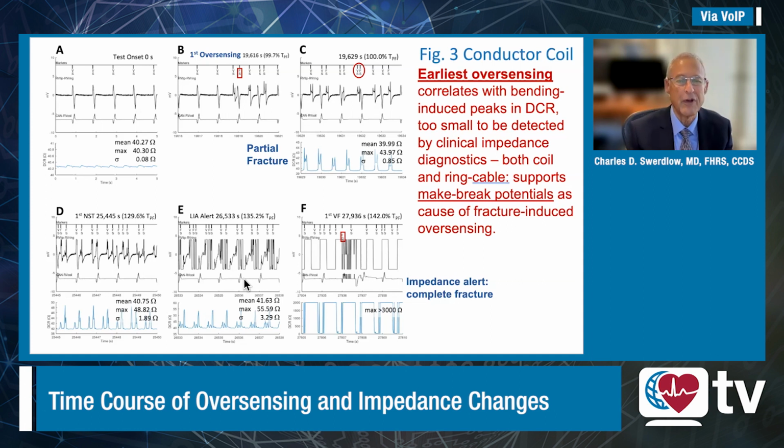High voltage conductor fractures are another issue. And then finally, as you pointed out, these electrograms in panel B are not the ones that we are used to thinking about. The earliest abnormalities in a lead fracture are discrete, limited oversensing electrogram changes that aren't the ones we see in textbooks that looked characteristically so-called noisy.